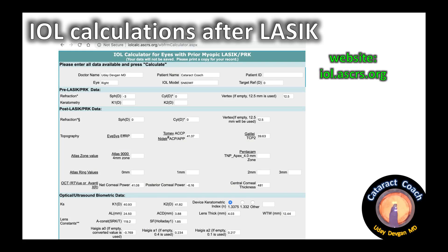Probably the most commonly used and useful calculator for post-LASIK eyes is at the ASCRS website: iol.ascrs.org. It's free and accessible to everyone. In this online calculator, we enter all the data we have. At the top right corner you enter the target refraction. In this case we do have pre-LASIK data: we knew the patient was minus 3 before surgery, and afterwards the patient achieved a plano refraction. We don't have the pre-op K values.